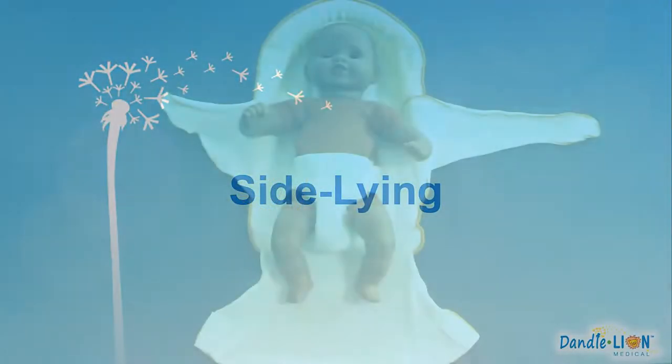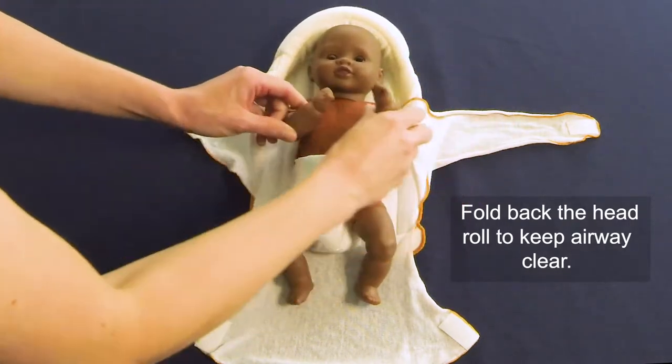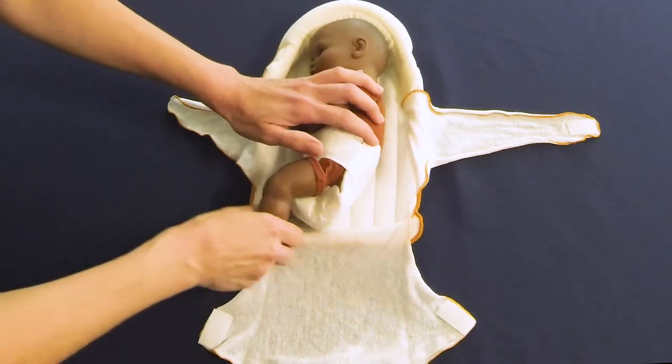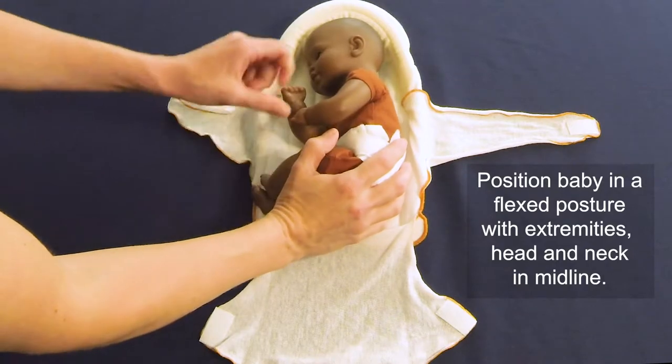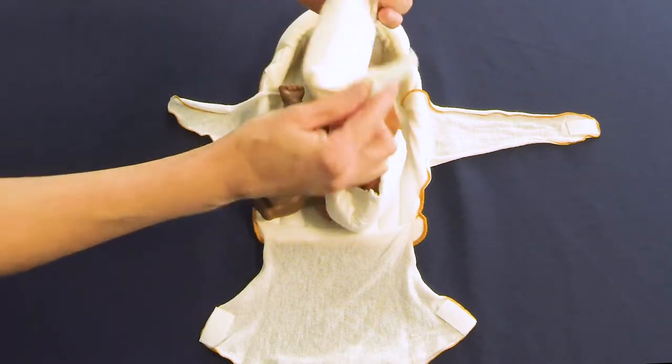For babies in a side-lying position, use the same principles as when placing supine. Place the baby in the Rulite with the head touching the head roll; the head roll should be folded down away from the baby's face. Ensure the baby's back is supported in a C-curve while maintaining alignment with the head and neck, keeping the knees and hips flexed.